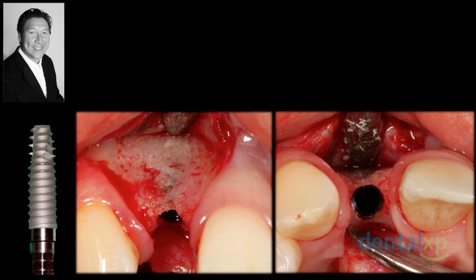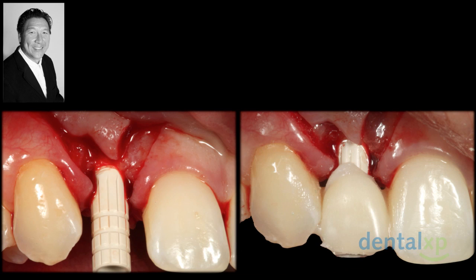He does have access, placing more to the palatal aspect, and then he can place a bone graft. The papilla-sparing procedure is not limiting his ability to gain access to this area. Before the graft is done, I'm going to make my provisional restoration so I have access to the site.